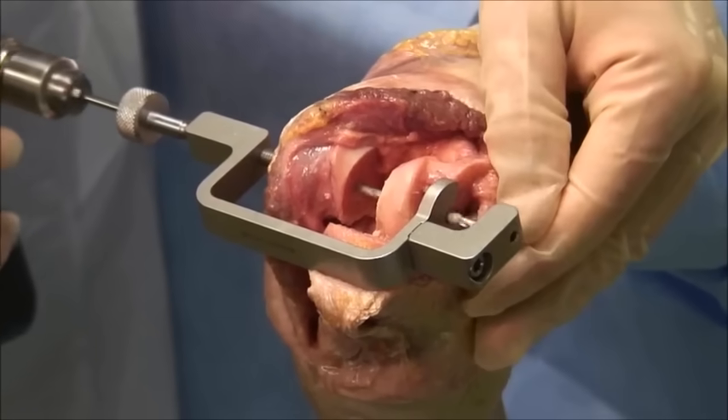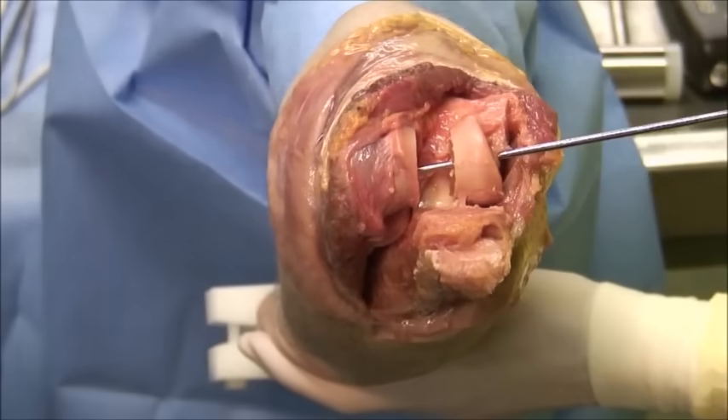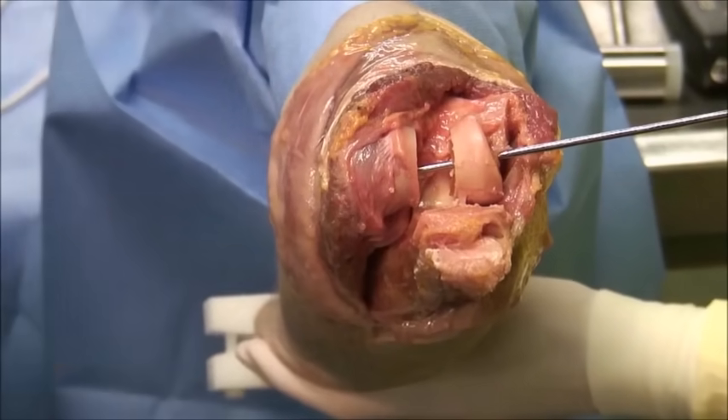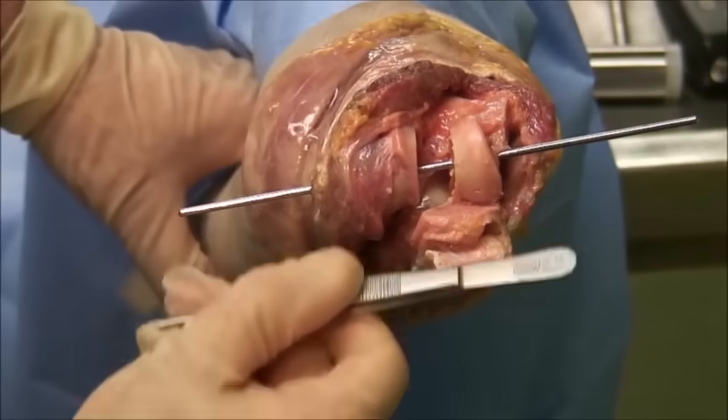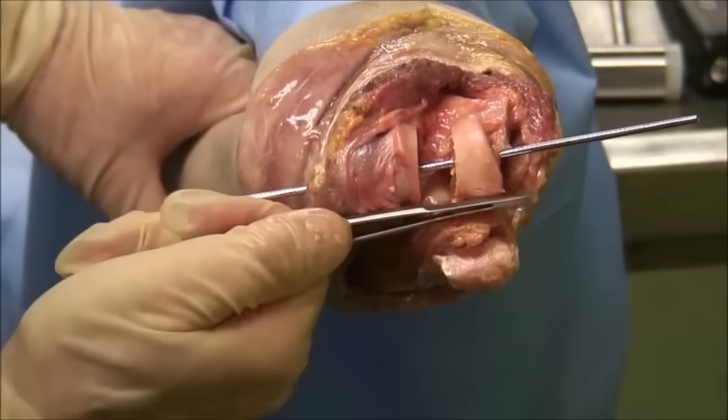Using the aiming device, a drill passes through all the holes, and as demonstrated, the center of rotation lies parallel to the scalpel which is placed on the articular surfaces.